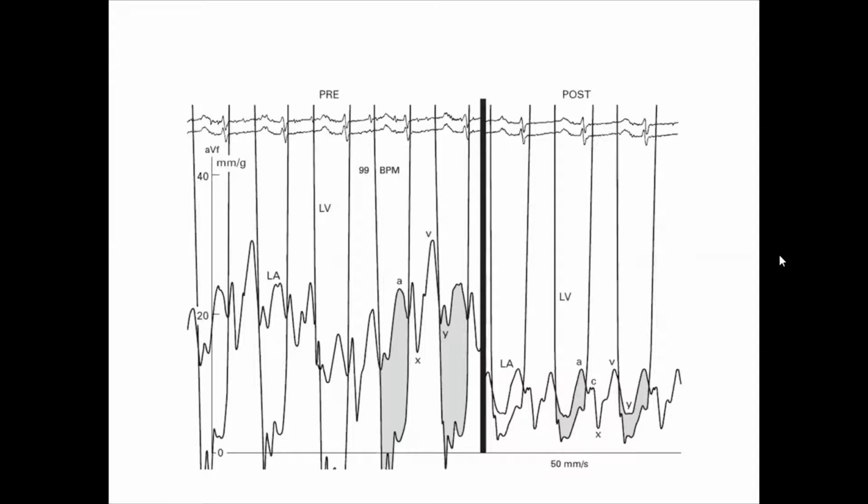This is number one. What about the left atrial pressure? Also, it drops significantly. Yeah, there is a reduction. So there is drop of left atrial pressure and significant drop in the diastolic gradient between the LA and LV. So this means the degree of mitral stenosis, if we calculate in numbers, maybe this is around 5. So decrease from severe to mild.